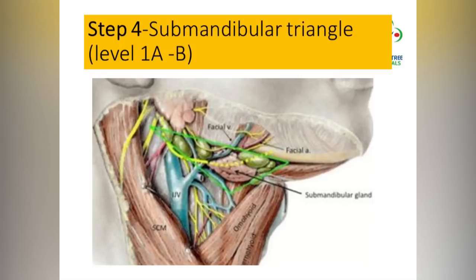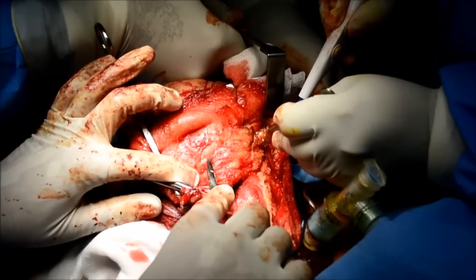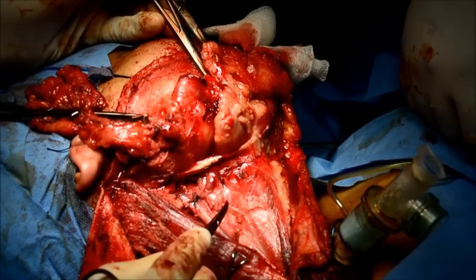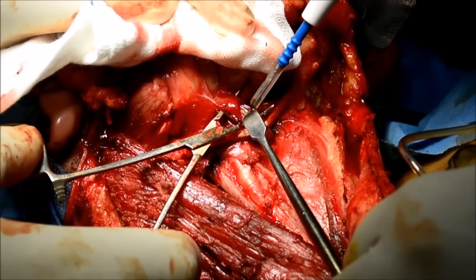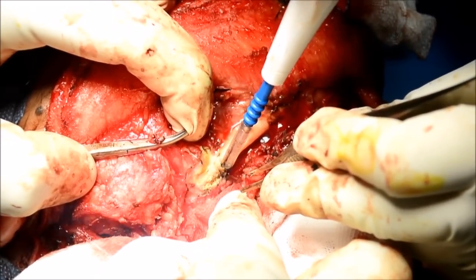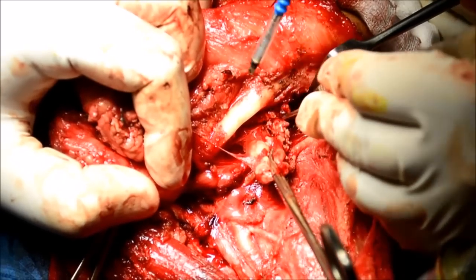The next step is to clear the submandibular triangle. Once you have cleared levels 2, 3, and 4, it is important to remember that you start the dissection on the opposite side of the digastric. The submandibular gland dissection is shown in a different video. Here we dissect the submental fossa and follow the digastric. In this situation we are preserving the facial artery and facial vein for microvascular anastomosis, and the digastric is cut for access to get the vein and artery for anastomosis. The classical submandibular dissection is then performed.